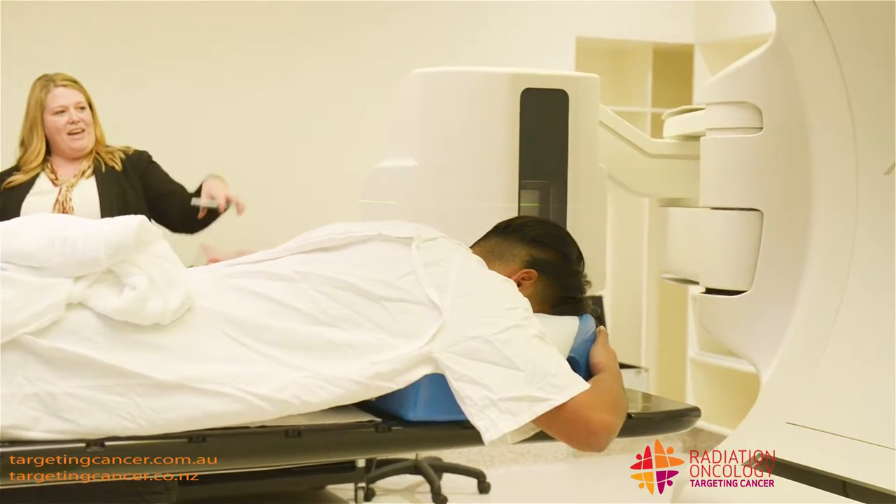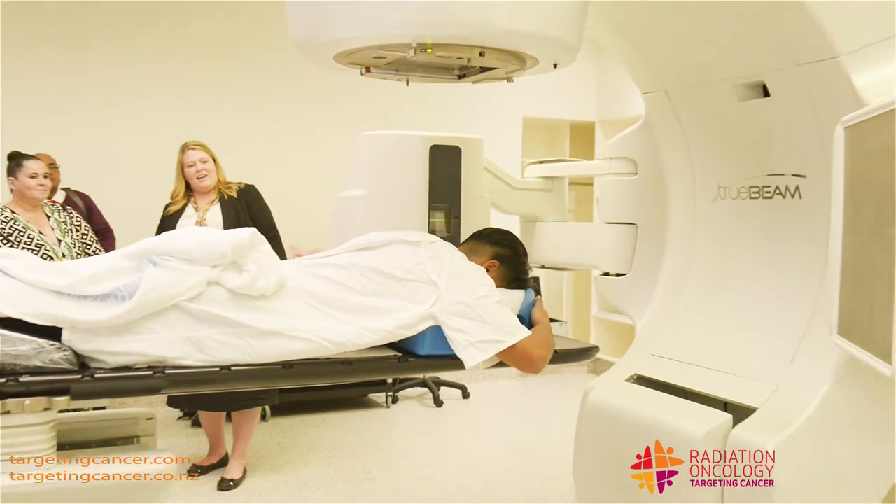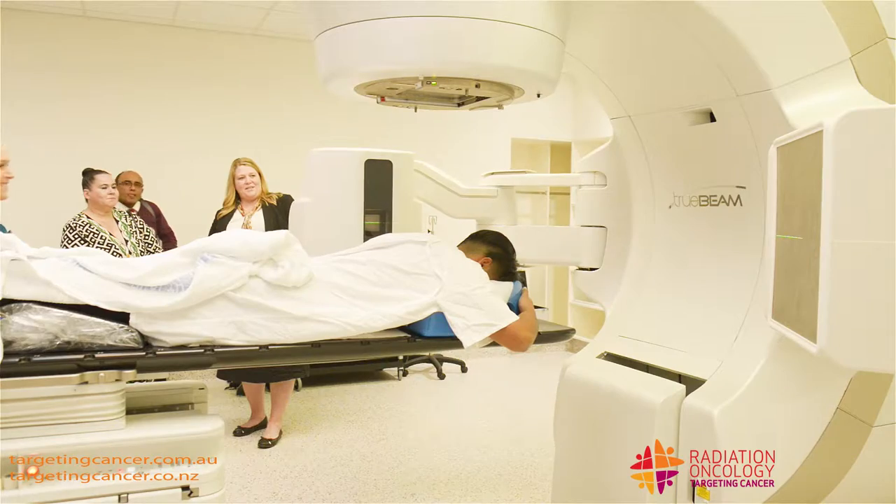After they've been set up in the right area, we use these arms here to take an x-ray to confirm that we're in the right position, which is what we're doing now.